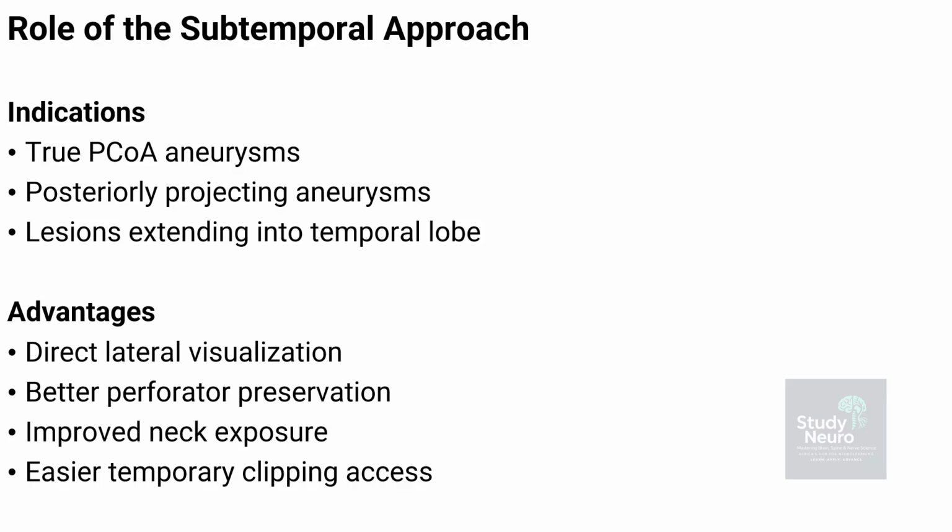One major advantage is better visualization of the aneurysm from a lateral perspective, which helps the surgeon identify and protect small perforating arteries while achieving a cleaner view of the neck for safe clip placement in a controlled manner. That clarity is valuable.